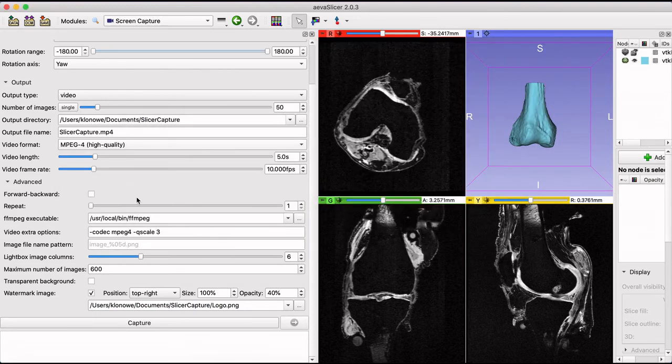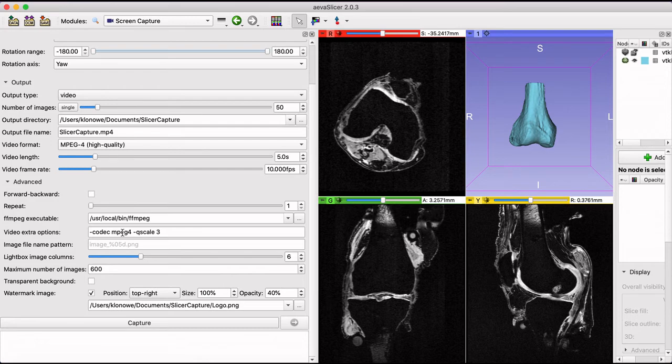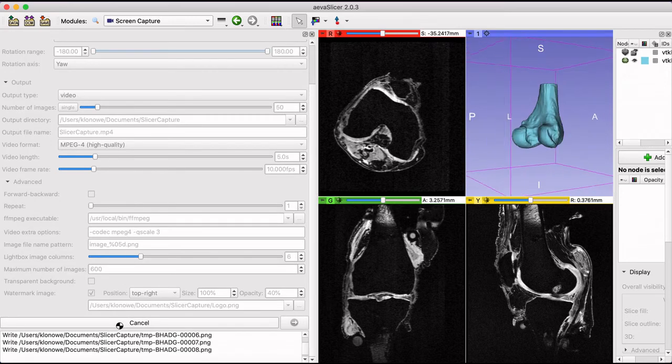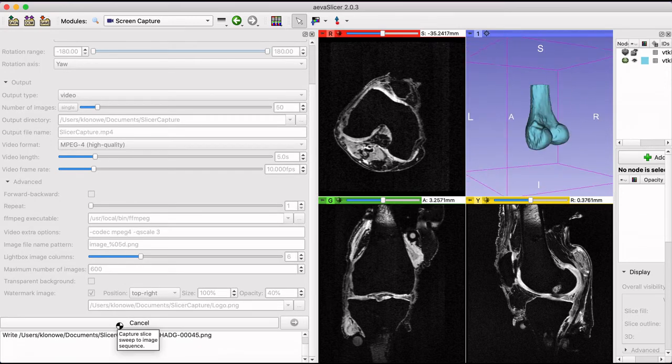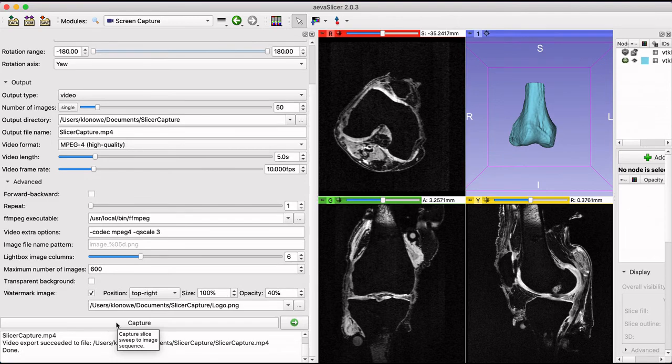You can hit capture to begin recording. Make sure to change the save file path if you choose to record another video as it will override the previous capture.